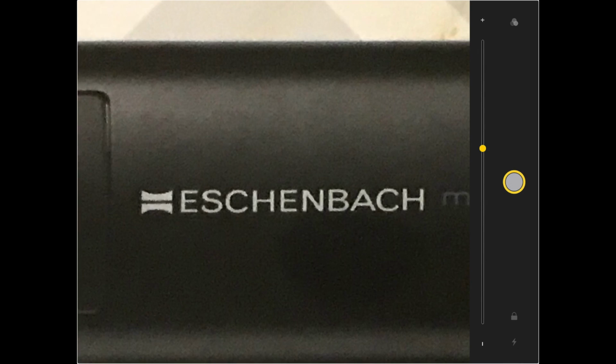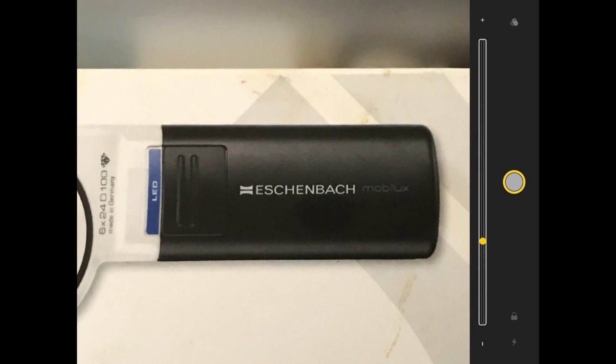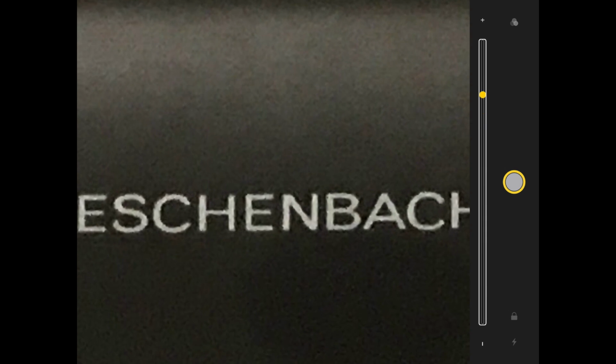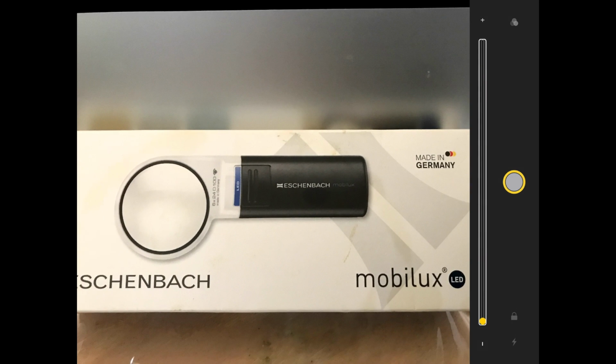To move out of that, select Focus, and then it goes back to the same image, but it'll zoom in and out on that. So if you need to take a larger photo, keep in mind that you can't move it around. All it'll do is zoom into what's in the center of the screen. Magnify all the way up to 15.0 times, then adjust all the way down to 1.0 times.